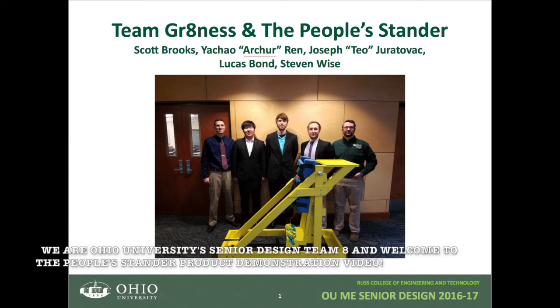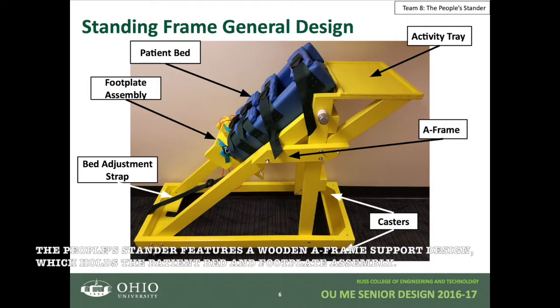We are Ohio University's Senior Design Team 8, and welcome to the People's Stander product demonstration video. The People's Stander features a wooden A-frame support design which holds the patient bed and footplate assembly.